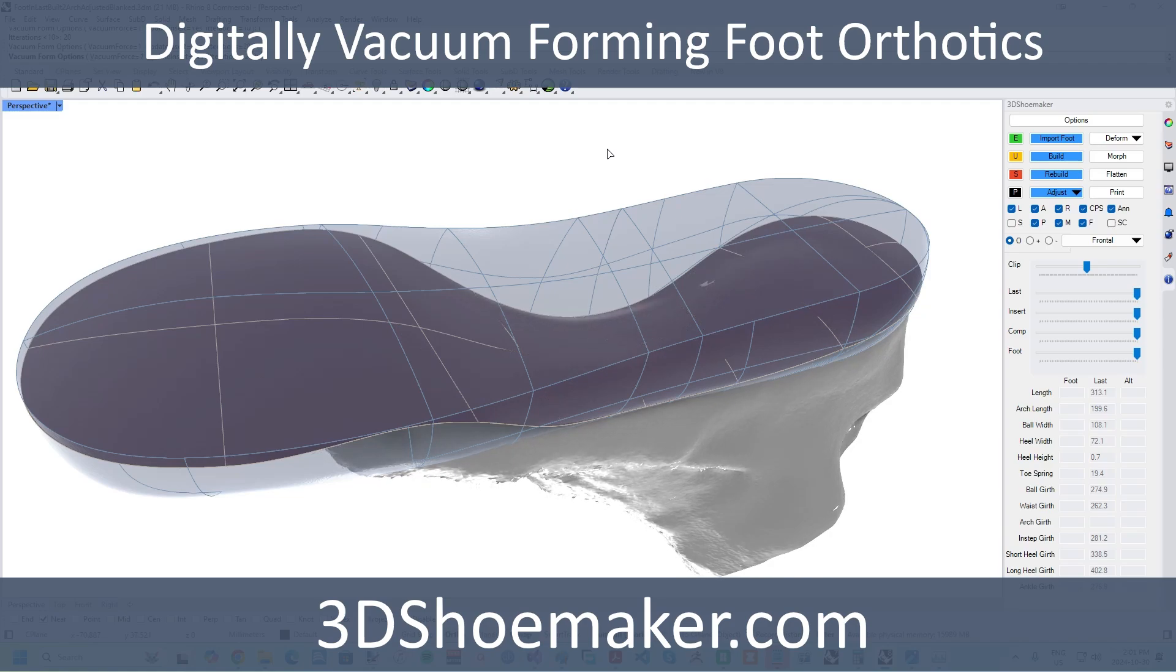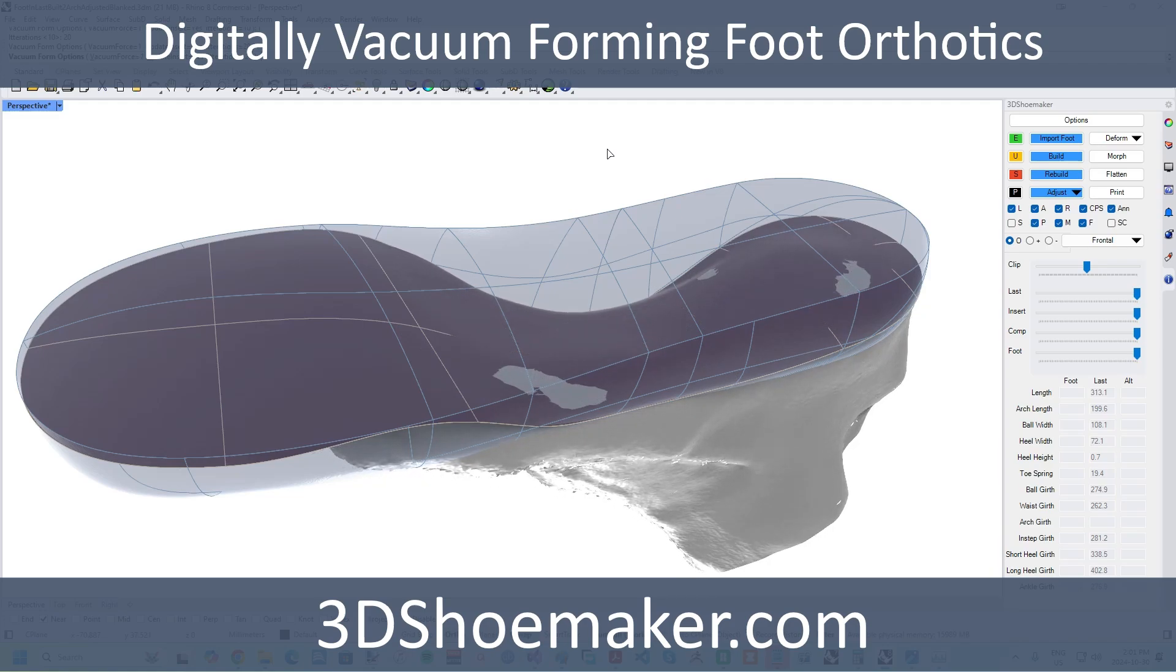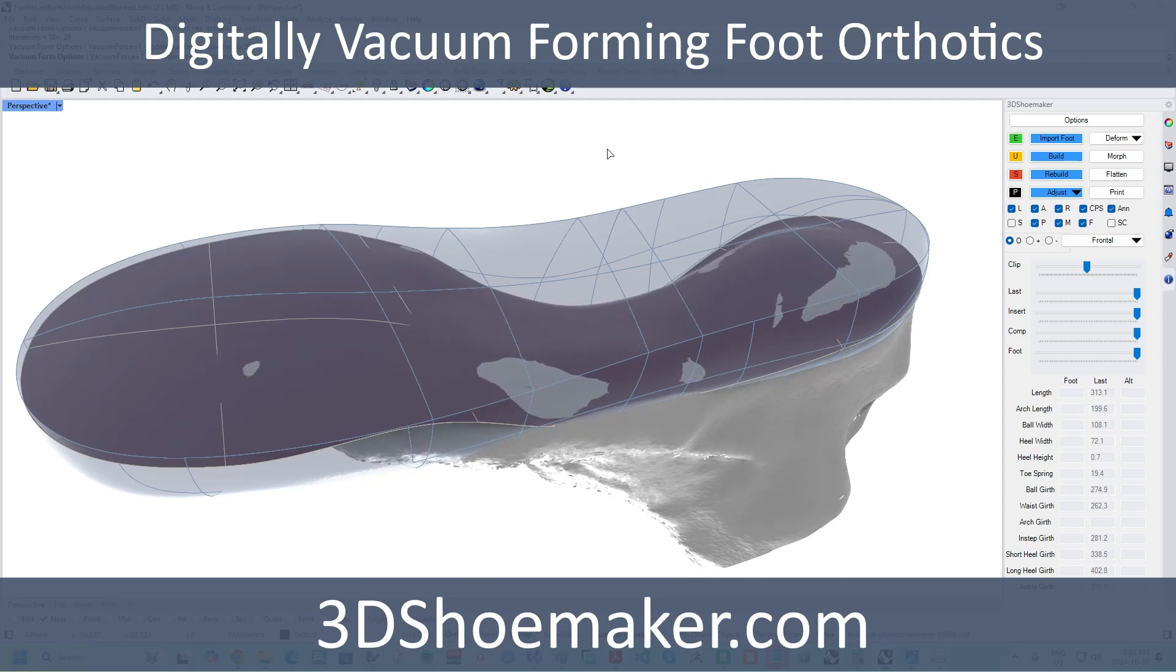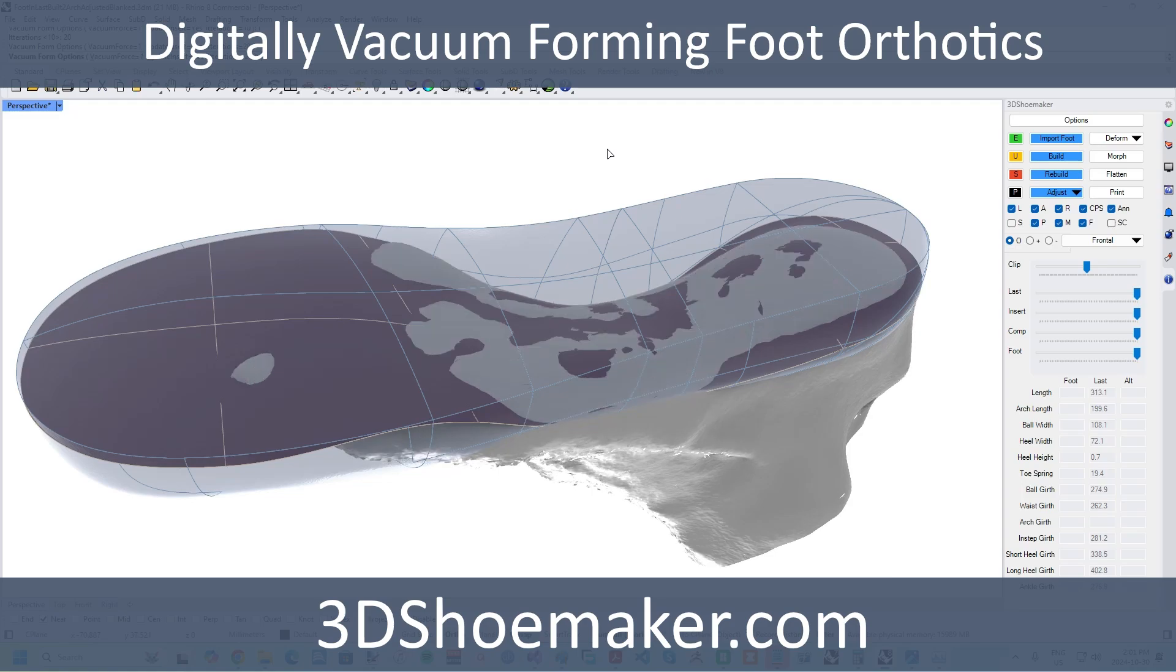In this 3D Shoemaker tutorial, I am going to introduce the new digital vacuum forming tool for automatically fitting orthotics to foot models.